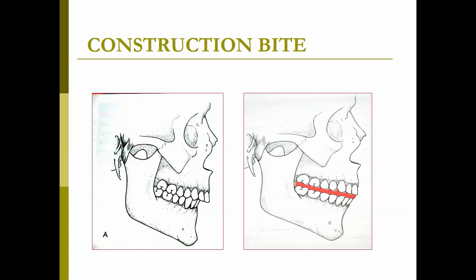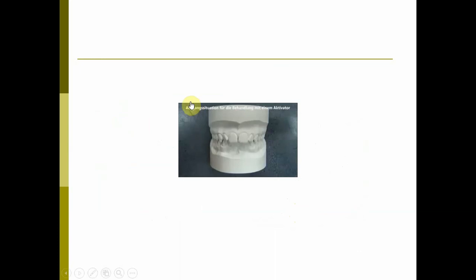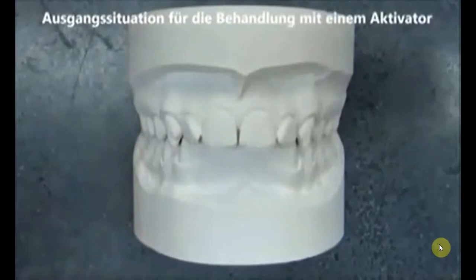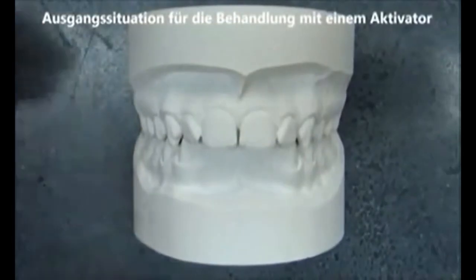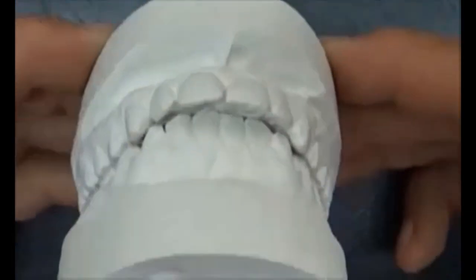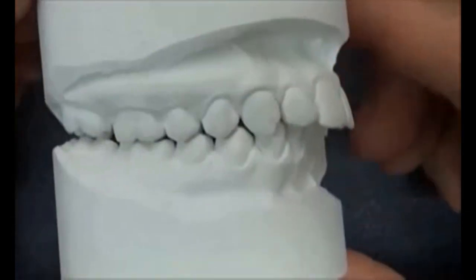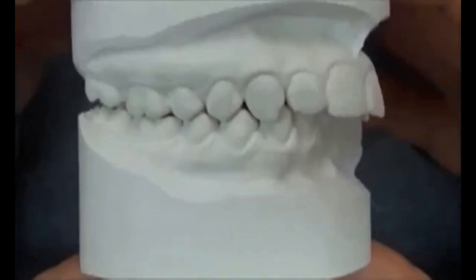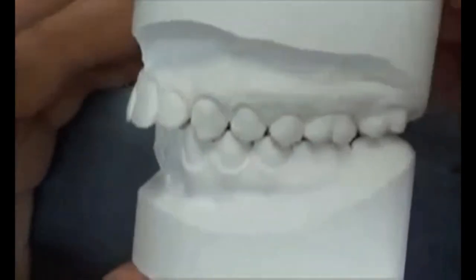So the patient will be forced to bite in this position instead of this with the appliance on. So this one is again a small video. These are the patient casts. So I'm just going to show you on the cast how we record the construction bite. You see there is increased overjet there. The molar relationship is also class 2 bilaterally. So I plan that we are going to give a myofunctional appliance to this patient.